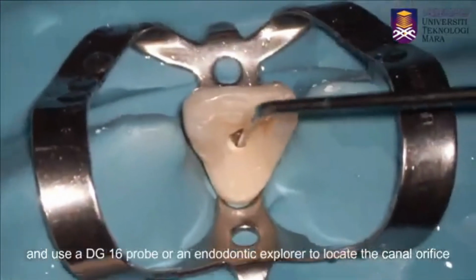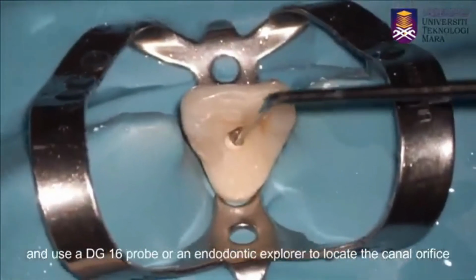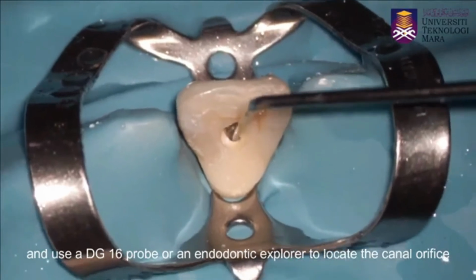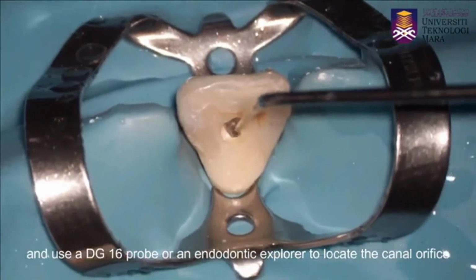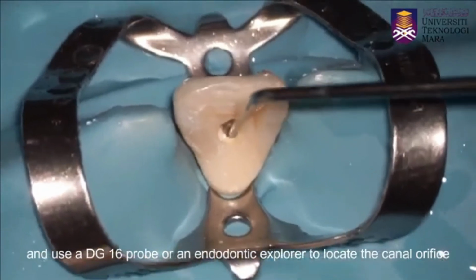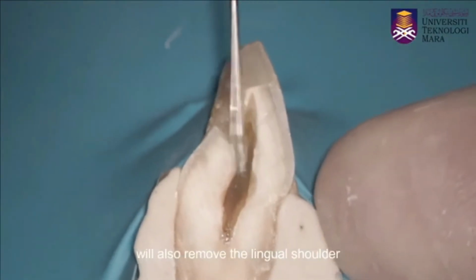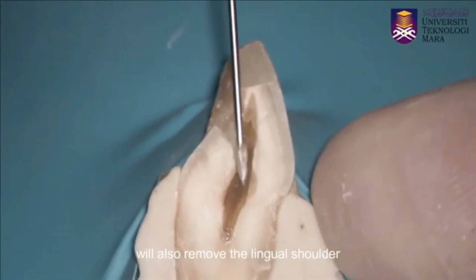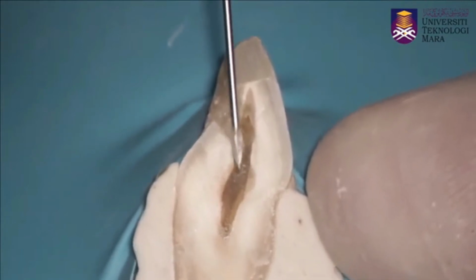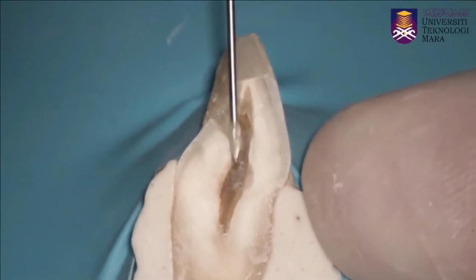Check the canal orifice for any calcific deposits, and also check for straight line access to the apical foramen. Once the canal orifice is located, you can remove the lingual shoulder using a Gates Glidden drill or a safe-tip diamond or carbide burr.